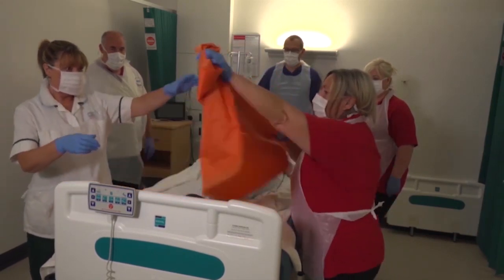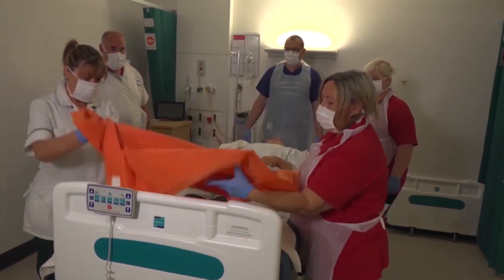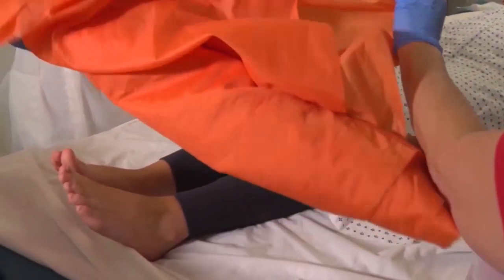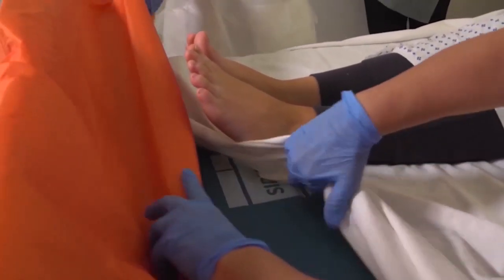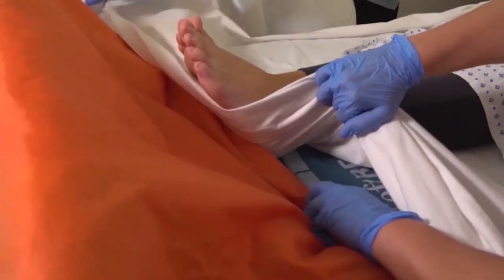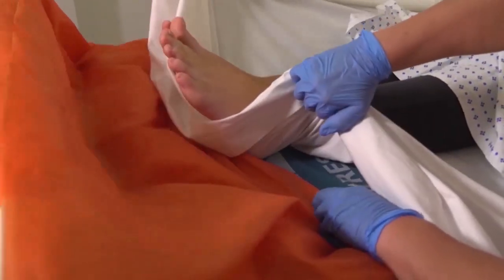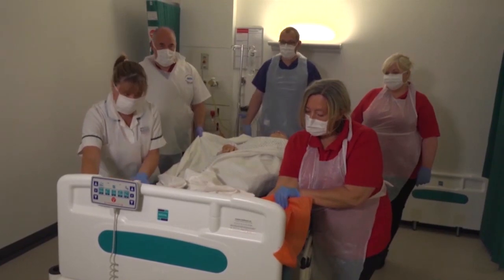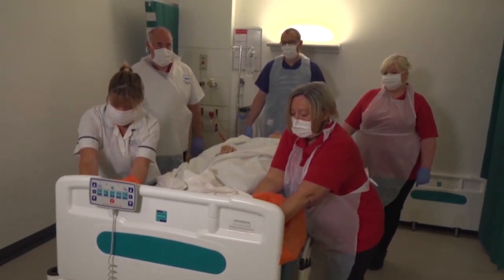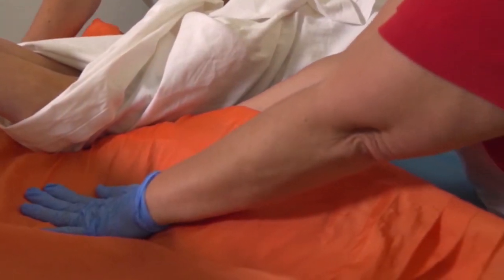We're going to pass the slide sheet so the sausage side is down, and we're going to take this underneath the feet and we're going to turn and face the bottom of the bed. We're going to place our hand underneath the slide sheet and place our other hand on top of the mattress, depressing the mattress.